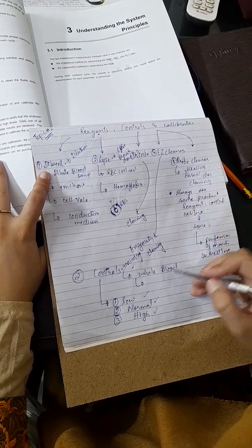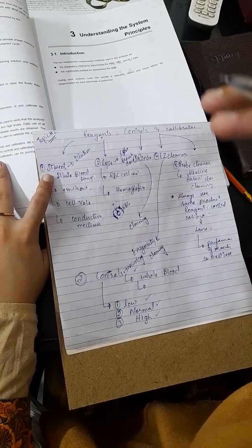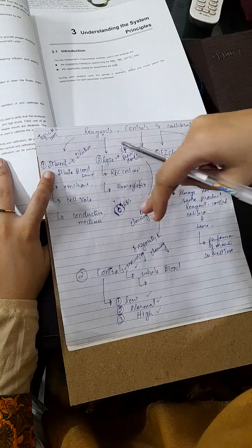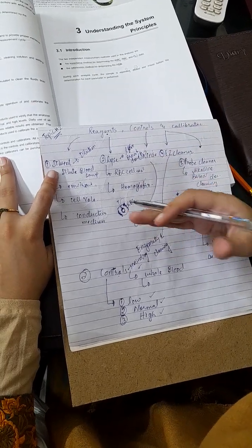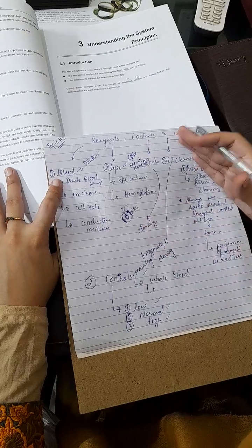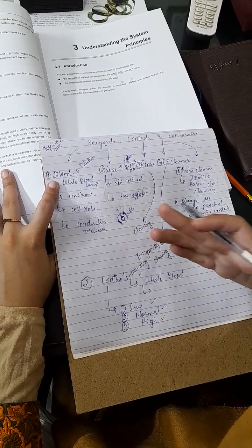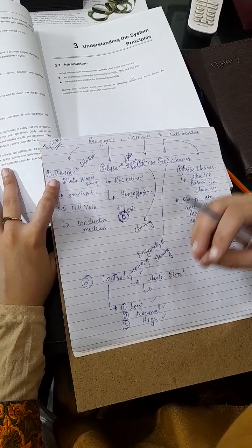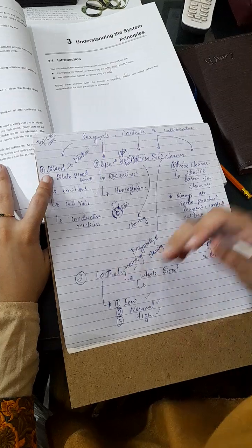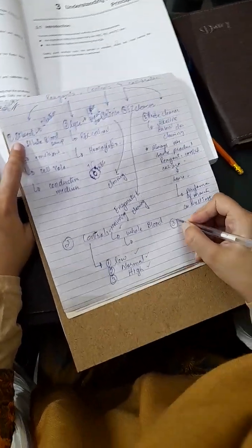If we perform all our samples with three levels of controls, and our controls are in range, as in the low control is in the low range, normal in the normal range and high in the high range, it means that our machine is calibrated and 99% of our results are correct. Now the last topic we are going to cover is the calibrators.